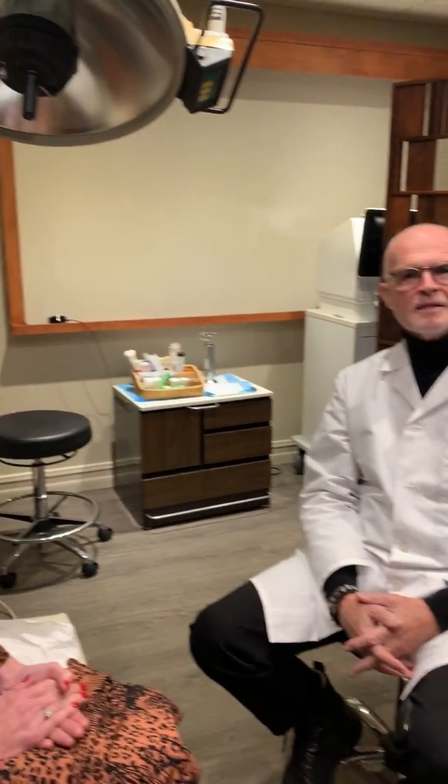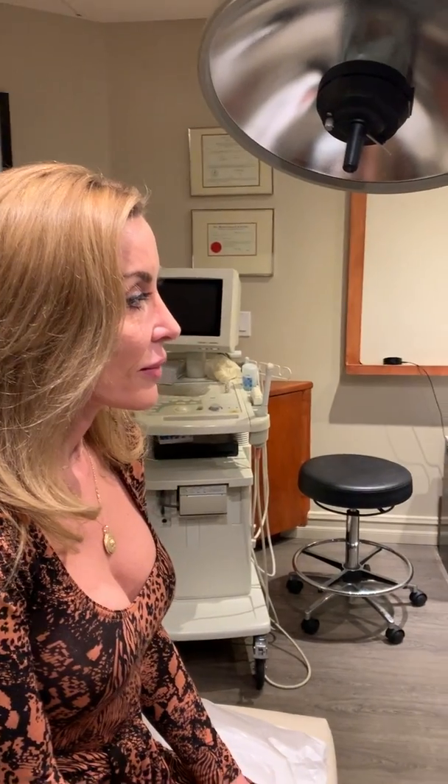Today we're going to use some pellets, one form of bioidentical hormone replacement for Lisa. It's become a very popular method of giving these hormones, and it's really convenient for patients. We insert it subcutaneously — it takes a few minutes to do. Patients love it because they can just forget about taking the medications for the next three to four months. It's a very safe way to do it.